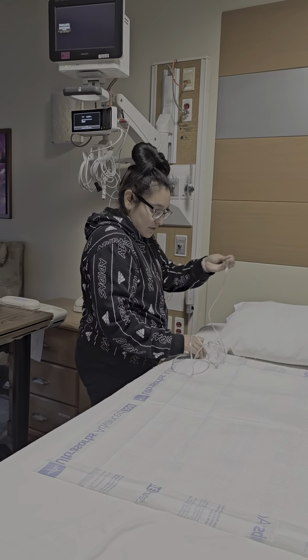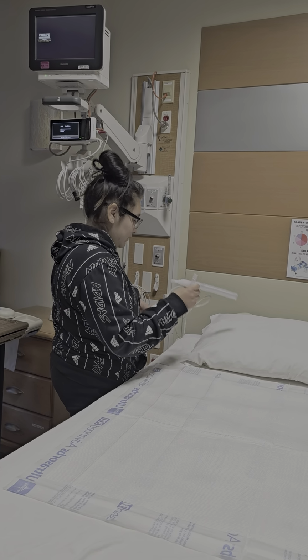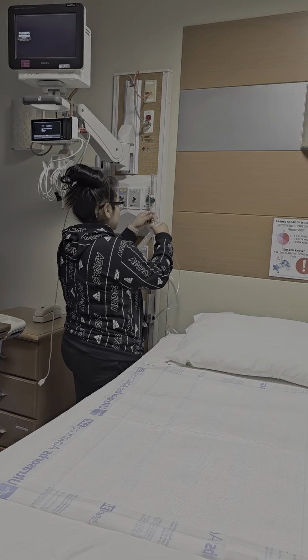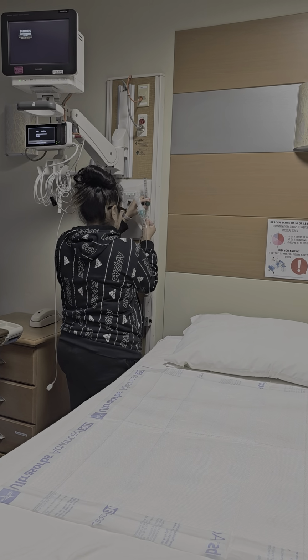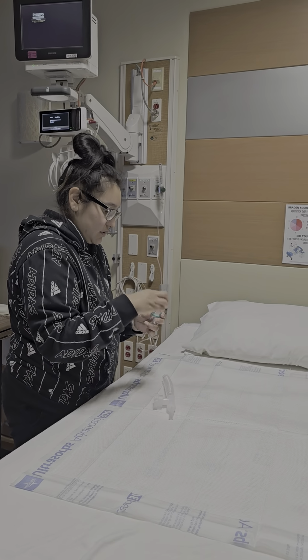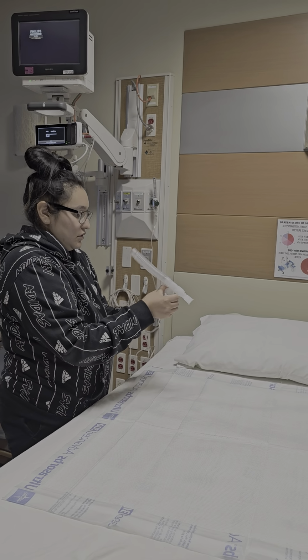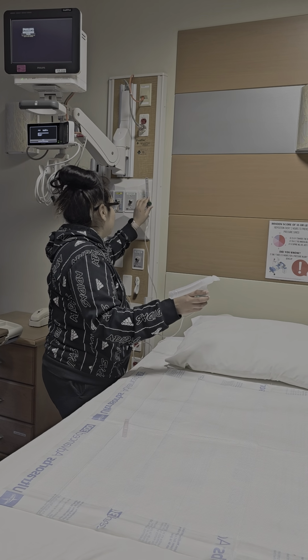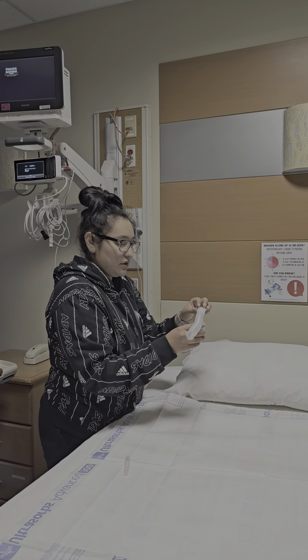Once you have your equipment here, you'll want to either choose oxygen or medical air. In this case, we'll use oxygen. And then you'll want to put your medication into the little cap here with a minimum of 3 milliliters. You'll want to turn it on to 6 to 8 liters. Then you'll instruct the patient to have a tight seal around the mouthpiece.